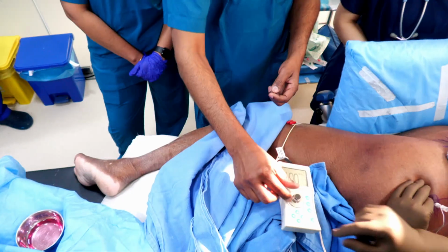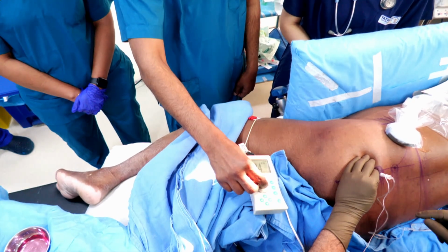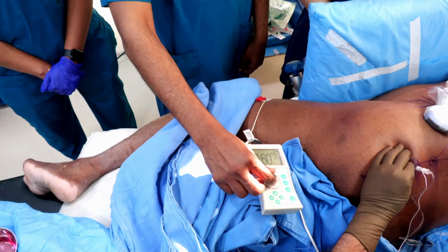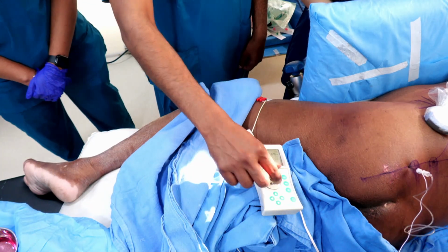So inversion. I'm going to decrease the current now. Now decreasing the current, at 0.8 I can still reduce it. Just want to exclude intraneural. Yeah, that should be fine. So at 0.4, we still have the contractions.